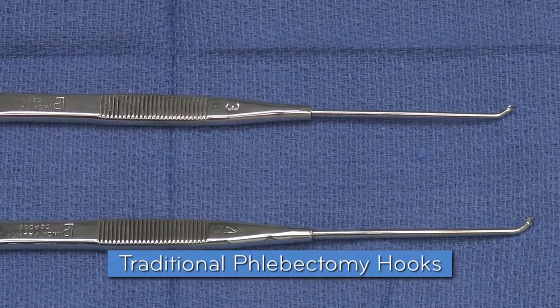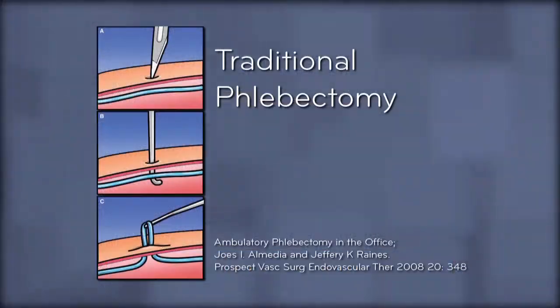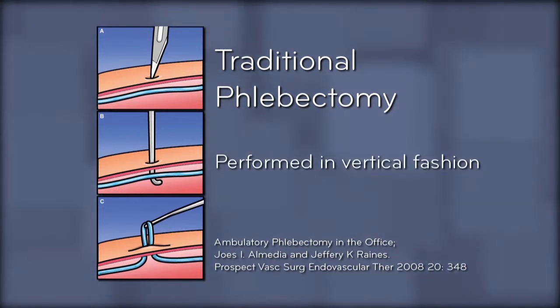Phlebectomy is a common technique used to clear varicose veins in modern vein practices. Traditionally, phlebectomy is performed in a vertical fashion where the vein is targeted by inserting a phlebectomy hook through a small incision directly over the vein. While this is useful for larger branch veins, it can be difficult for smaller veins.